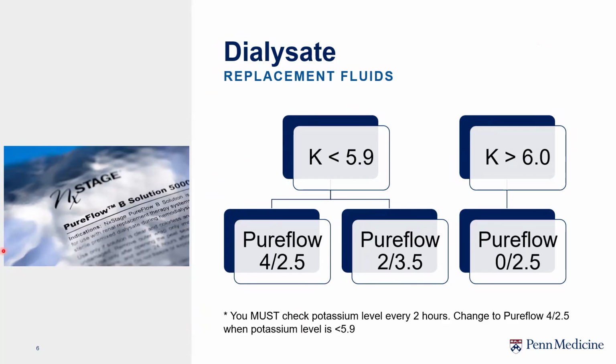So we do have the option between 0K, which is no potassium, 2K, which is a middle amount of potassium, then the 4K, which is actually closest to our serum level of K. Again, if you think about it, we like to keep our potassium around 4 when we're getting our BMPs. So a potassium of 4K is as close to a serum as you can be.